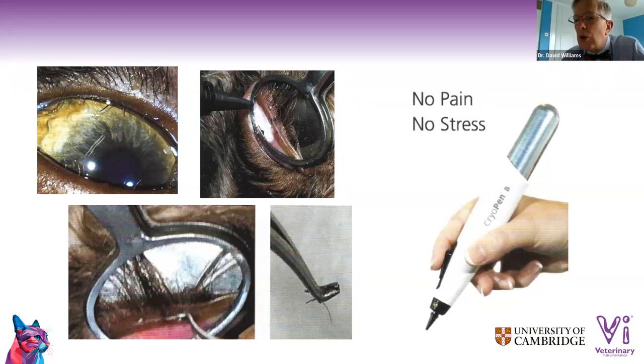And CO2 laser, I haven't. It's possible. I'm sure someone with a CO2 laser might have done it. I would have thought that's a bit too powerful. I don't really know. I've never used a CO2 laser myself. I think it may cause too much damage to the eyelid edge, because then you'd be going, as it were, down into the distichia themselves. And so I think there's a problem.